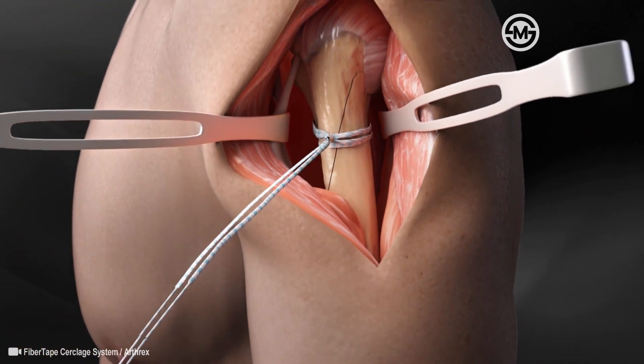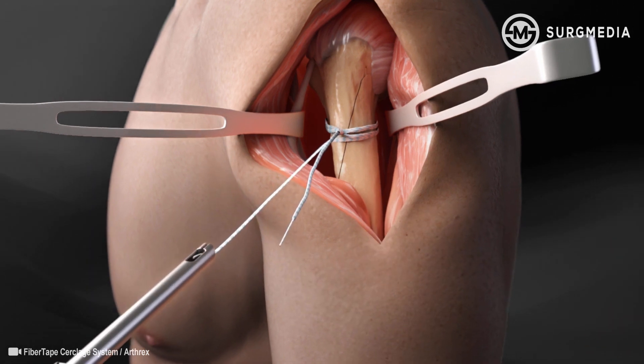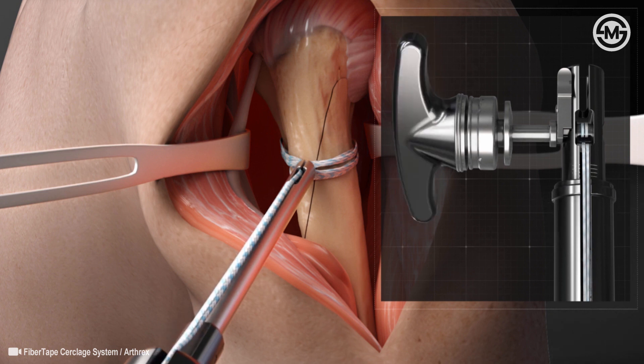The suture swedge is then cut to separate the two tails of the Fiber Tape Suture. The suture limbs are loaded through the two holes at the tip of the tensioner and then loaded into the slot of the roller adjacent to the handle. The suture is then tensioned to the desired tension.